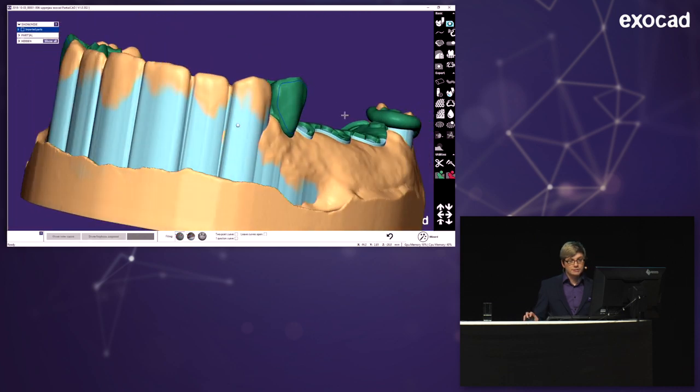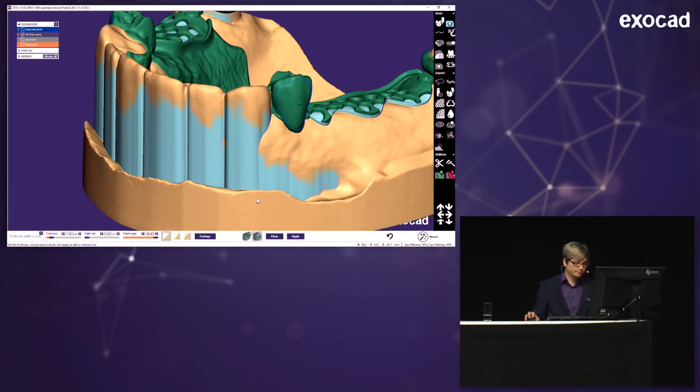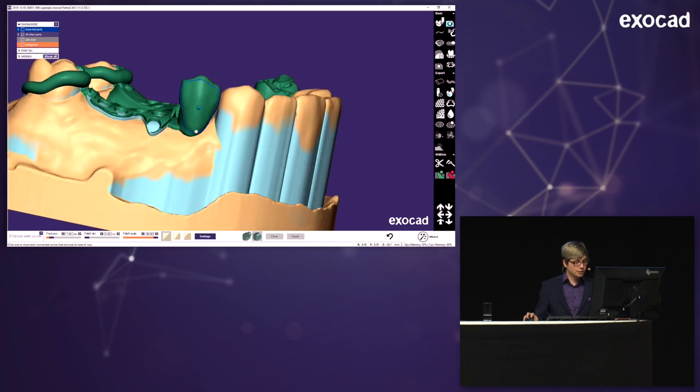And now there's an option here. You see there's a plethora of tools. And there's an option here where I can emboss something. I'm just choosing a curve and have here a thickness of 1 millimeter. And it will just emboss 1 millimeter of material there, you see? I'm using the same one here.